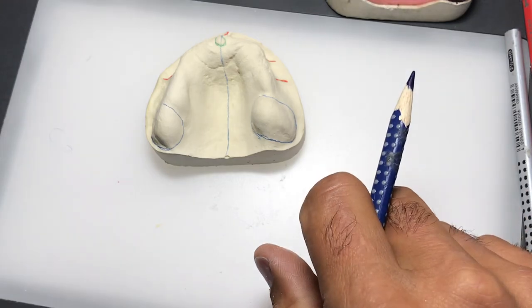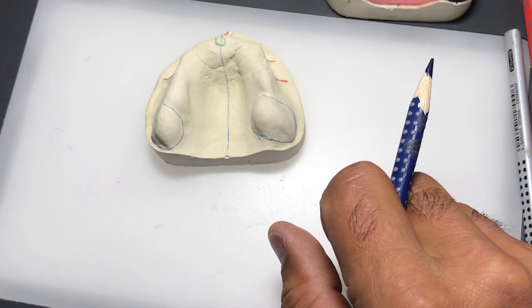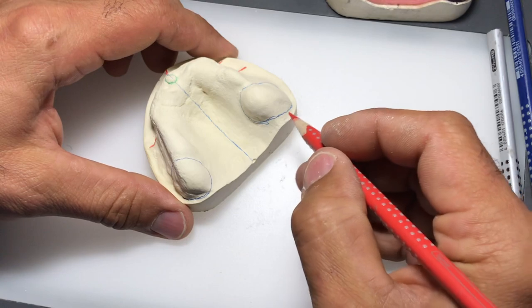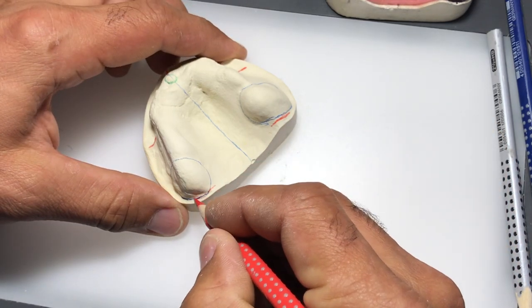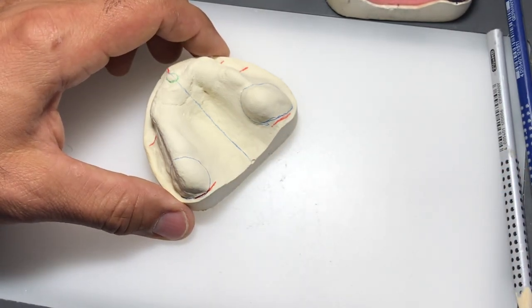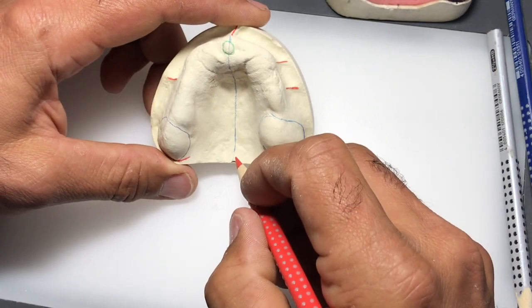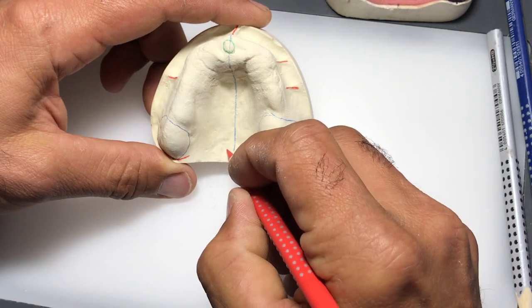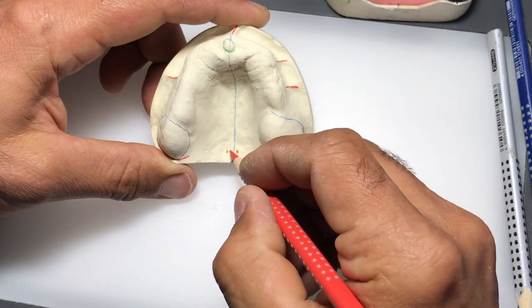It's very important to identify the tuberosities because just behind - posterior - to the tuberosity we have what we call the hamular notch, which is this little depression just distal to the tuberosity. Somewhere on either side of the midline back here, these can become very vague to identify on a cast. There are also a couple of little depressions - dimples - what we call the palatine foveae, and we need to identify those.